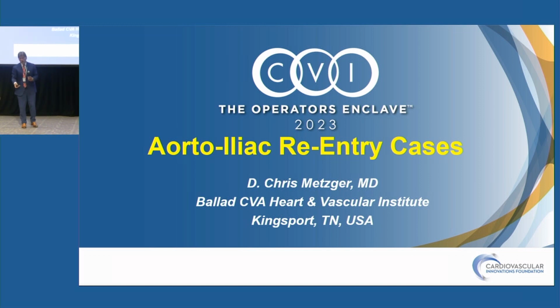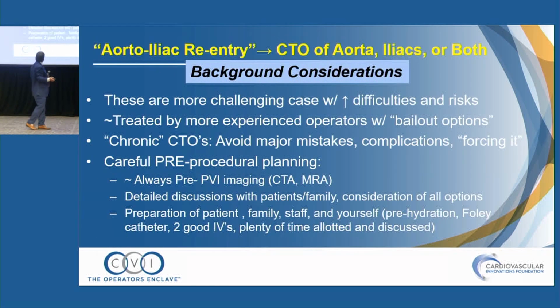All right. So honored to be here. Aortoiliac. If you start the clicker here. There we go. All right. Disclosures. I just want to give a couple of background points, and then we're going to skip to a couple of the good cases, and we'll just make them interactive and fun.